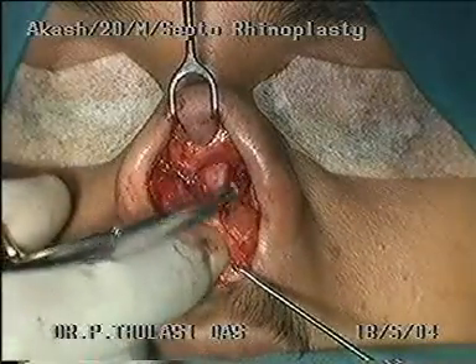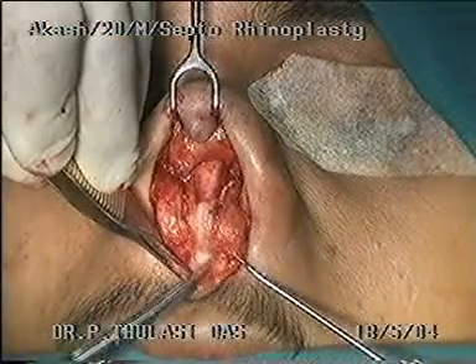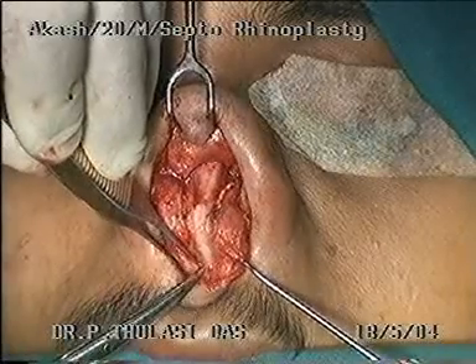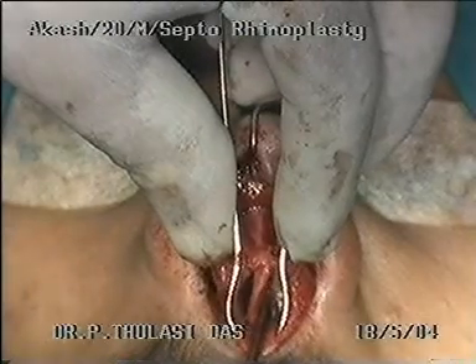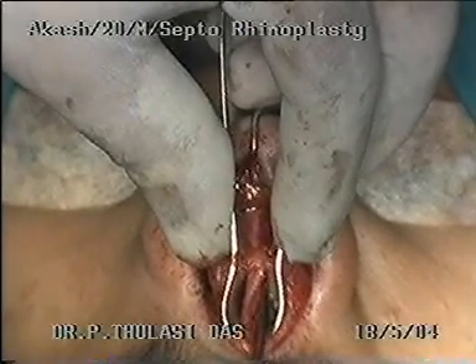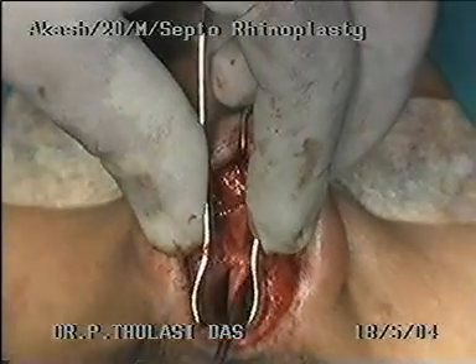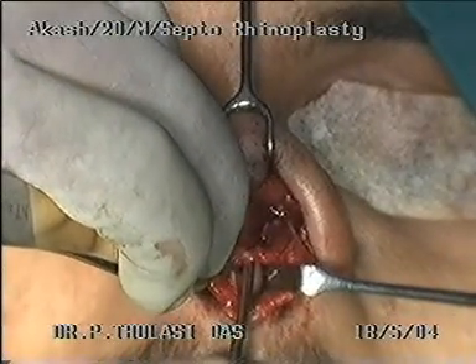The caudal border of the septal cartilage is identified. The perichondrium is tightly adherent to the cartilage in this area. With some sharp dissection, the mucoperichondrial and mucoperiosteal flaps are elevated on both sides to skeletonize the septal cartilage. The elevation of flaps on either side is generally done by feel rather than by vision.